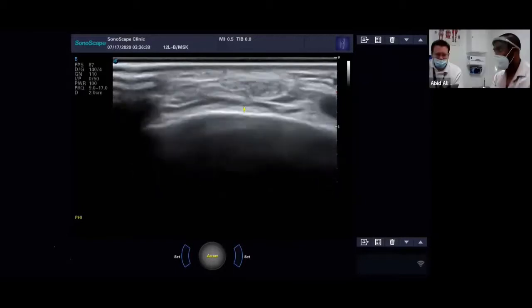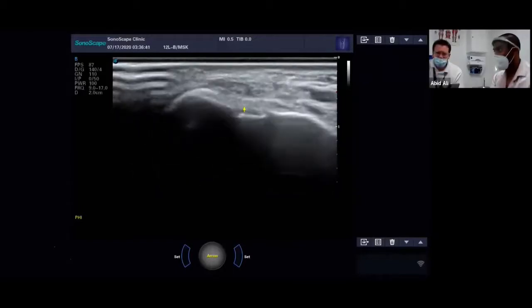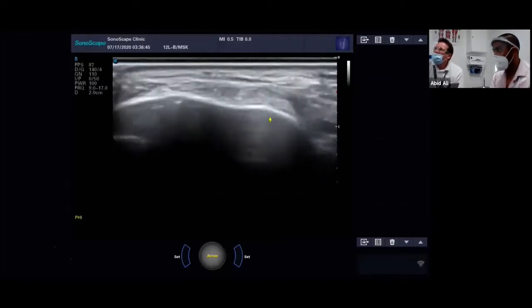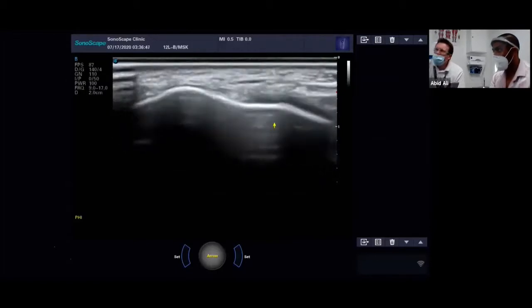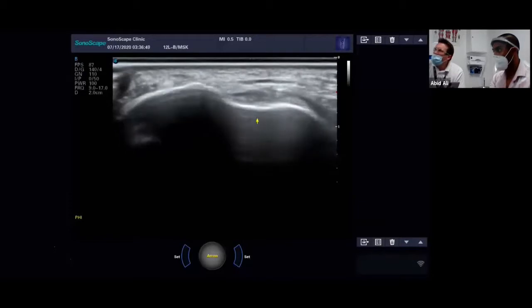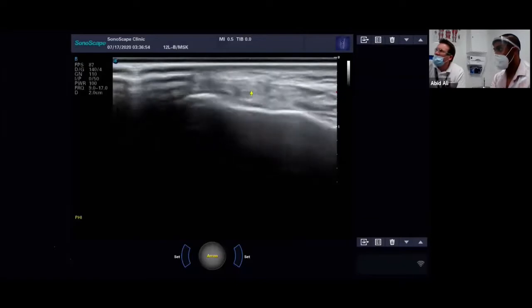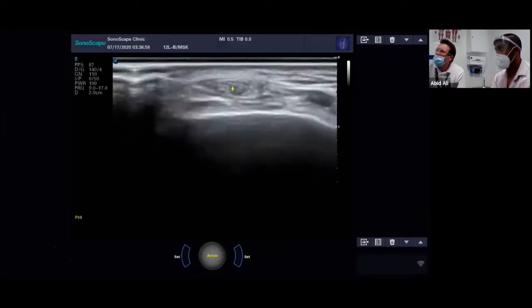All right, so we can follow this right to the insertion as well, and you'll start to see it and its attachment and it thinning out and fanning out into the bones. We're about here. I'll take one off the screen now, sorry. There you go. There. Yeah, trying to keep it in the centre.